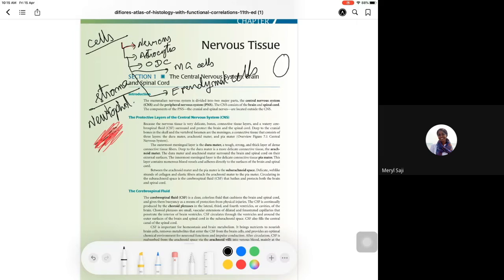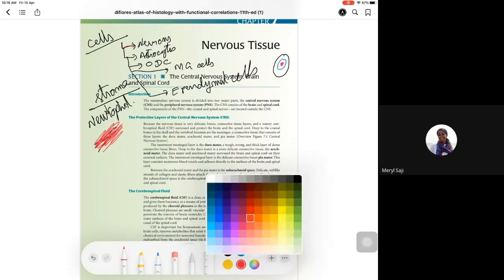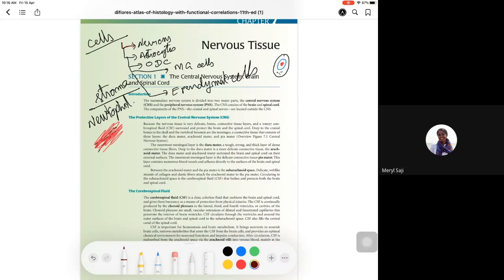They will have a plump cell, like a plasma cell, and they will have a vesicular nuclei, and a prominent nucleoli. And more importantly, they will have Nissl substance. Nissl substance will be more brownish granular material in the neural tissue. So this is a neuron.